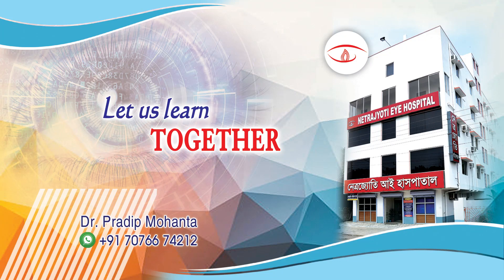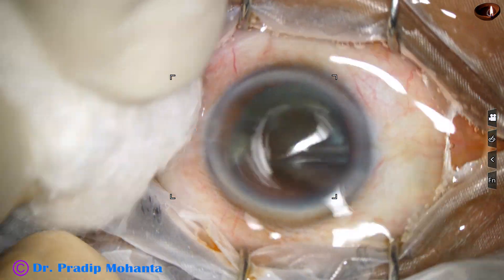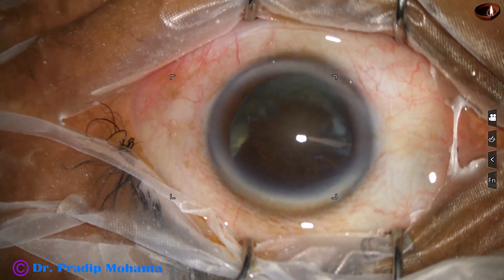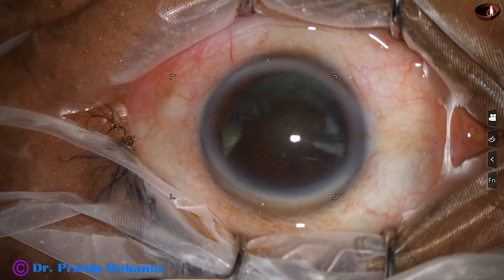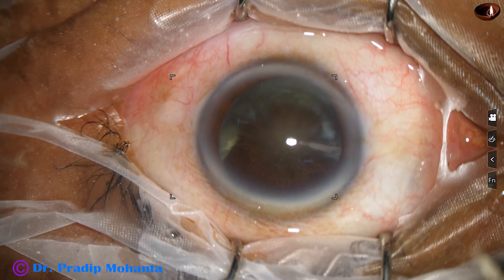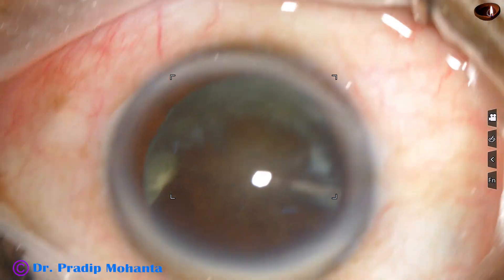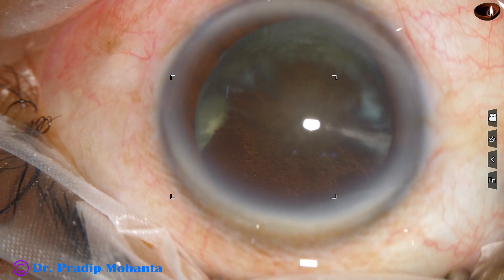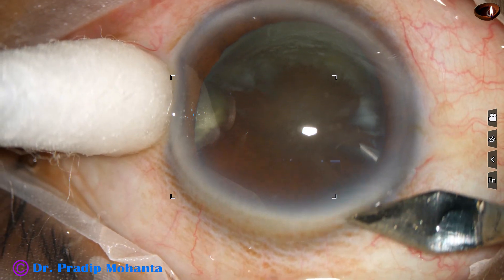Friends, welcome to my workplace at Ranagh Heart, West Bengal, India for hands-on FACO training. This patient is suffering from diabetes mellitus for the last 13 years and has cortical cataract and posterior subcapsular cataract. The lens matter is very sticky in such cases when the patient has been diabetic for more than a decade.